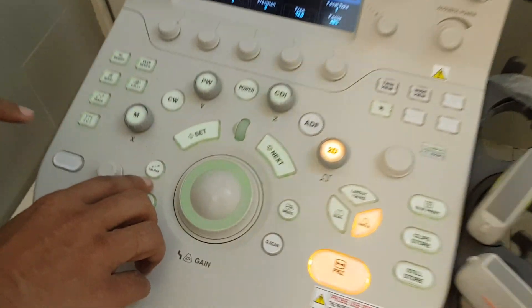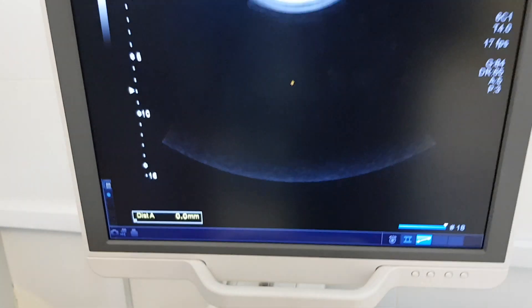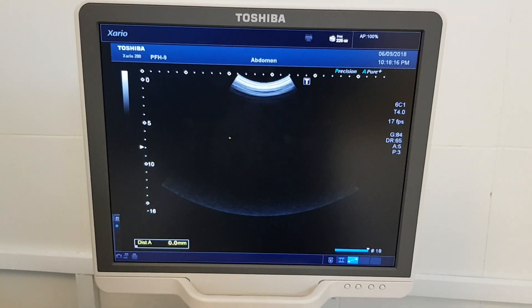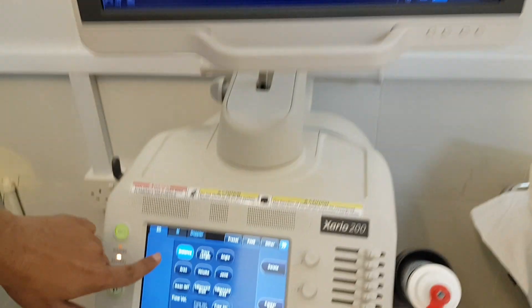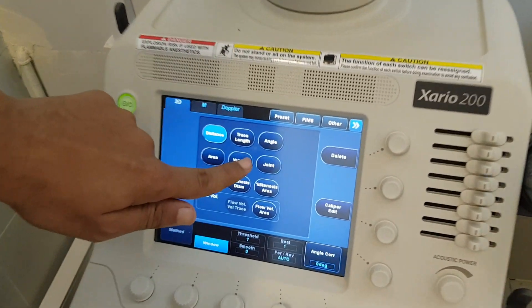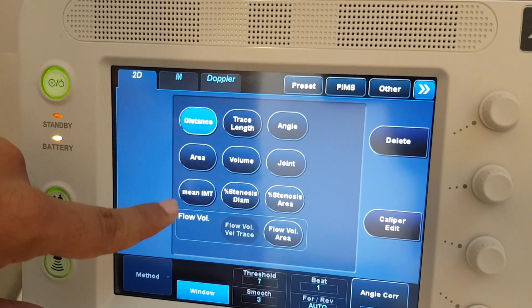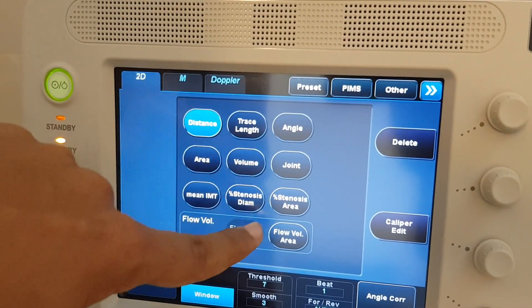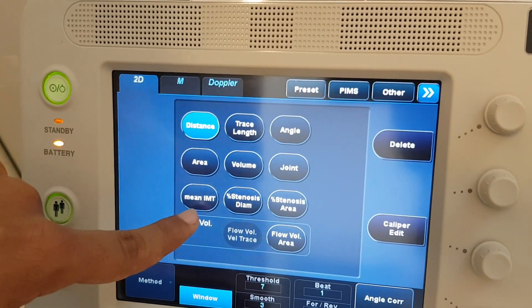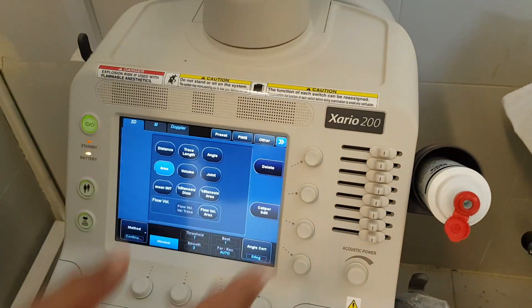With these presets, the important thing is the caliper. The caliper is also used as a straight line, meaning you can measure distance — but not only distance. When you look, there are many parameters on the screen: distance, area, volume, angle, joint, stenosis, diameter. Whatever you have to measure, you will click on it.